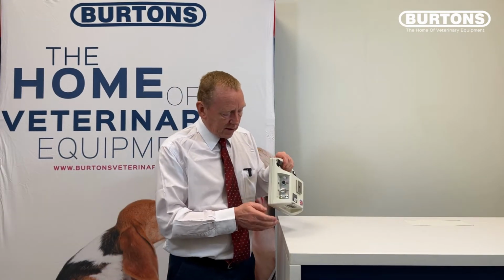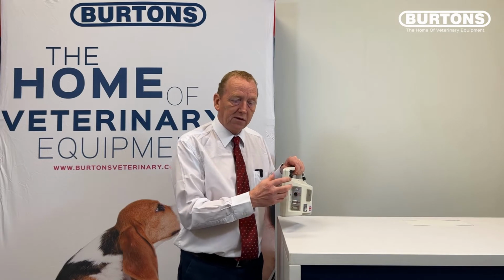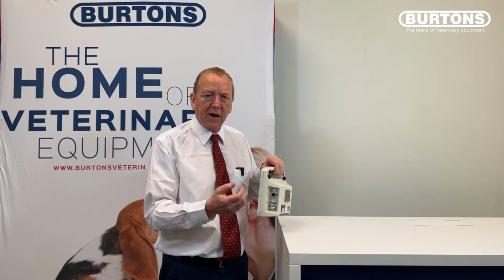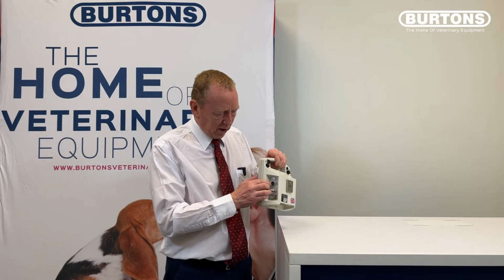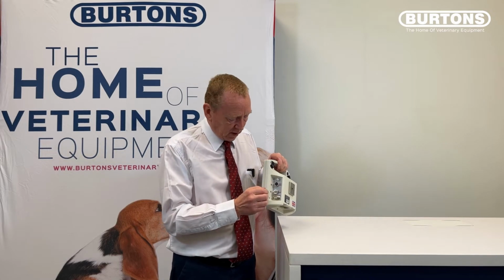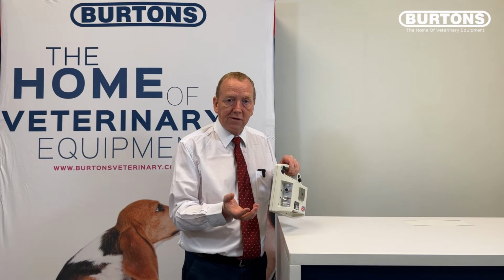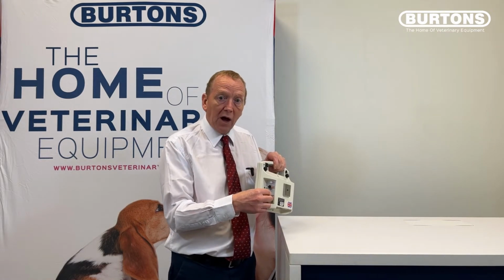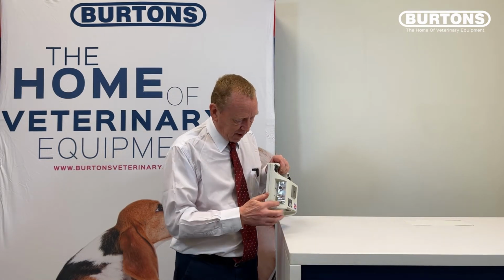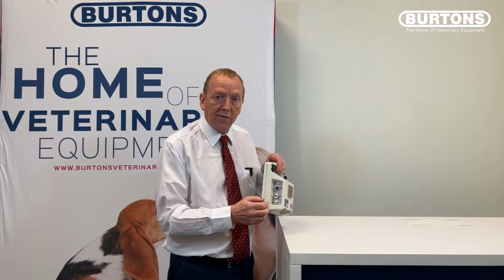So, for example, on this side we have four connections. At the top we have the side stream CO2 return. This is where the side stream CO2 gas is fed back into the waste system. The second connector is our IBP, or invasive blood pressure connector, and we have an option here for one or two channels. The one below is the NIBP, non-invasive blood pressure, or our oscillometric system, and our NIBP hose will go into this connector. And finally, at the bottom here, we have the pulse oximetry connection for our pulse ox cables.